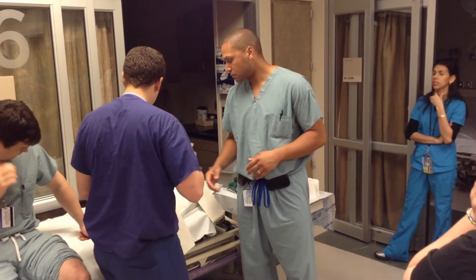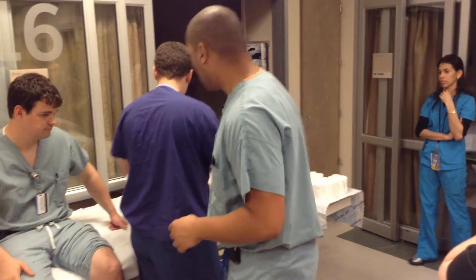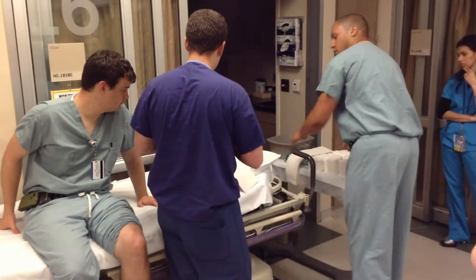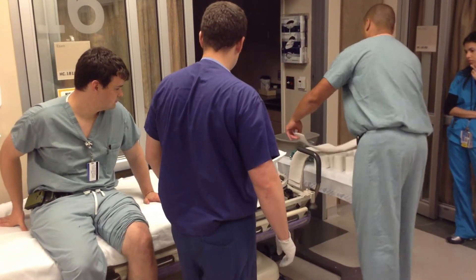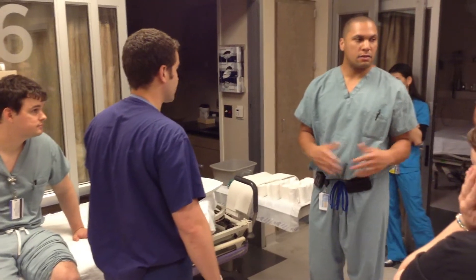It's better to have too much padding than too little. We like to use the 5x30s on these ankle splints. And ortho glass — don't use it.